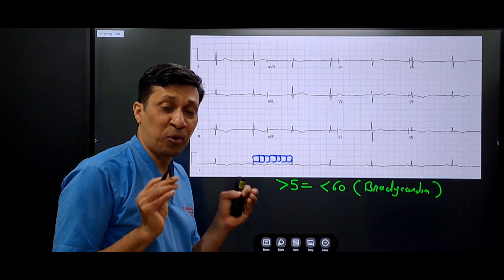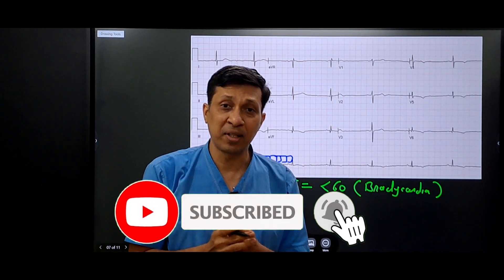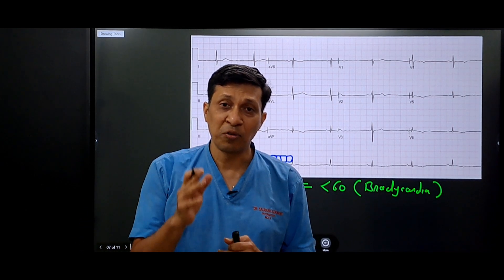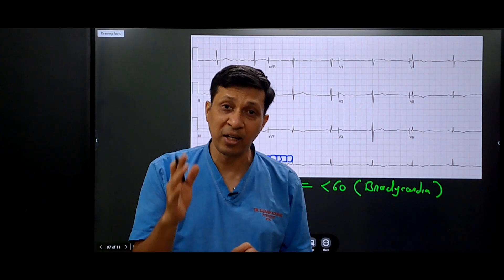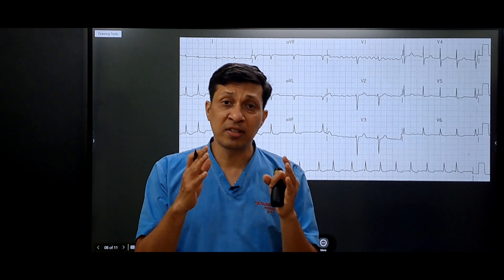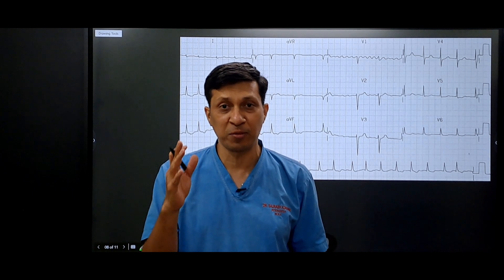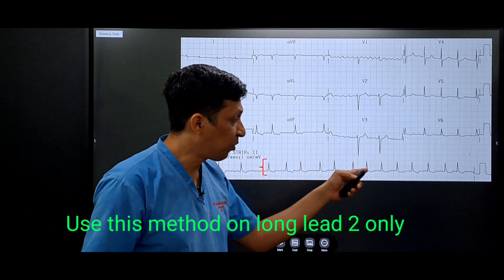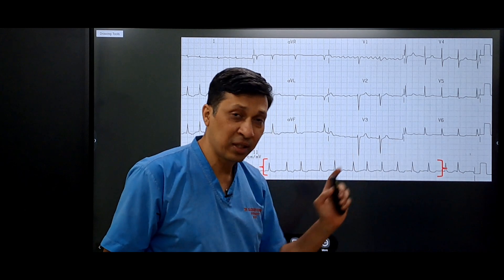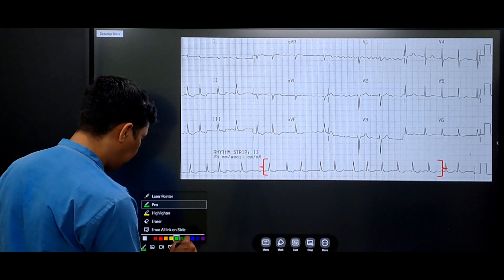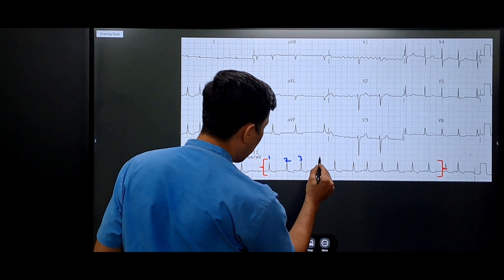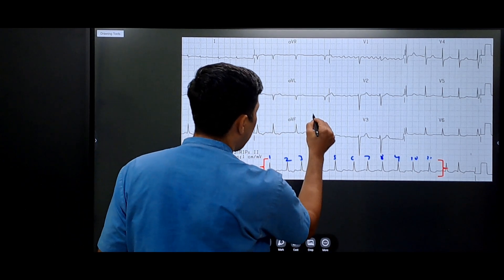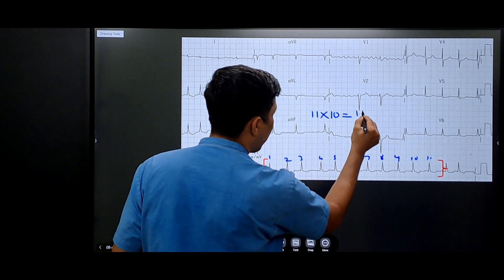Now let's see how heart rate is calculated for irregular rhythm. When the rhythm is irregular, we use the 6-second or 30 large box method. We start from a point and count 30 large boxes to mark the 6-second window. Within that window, we count the number of R waves: 1, 2, 3, 4, 5, 6, 7, 8, 9, 10, 11. The heart rate is 11 multiplied by 10, which equals 110. That is the heart rate of the patient.